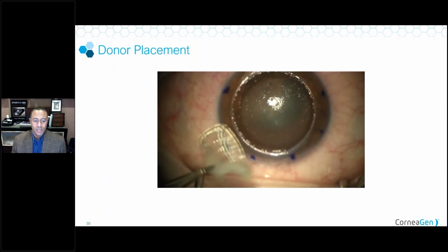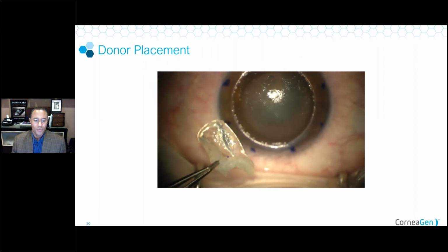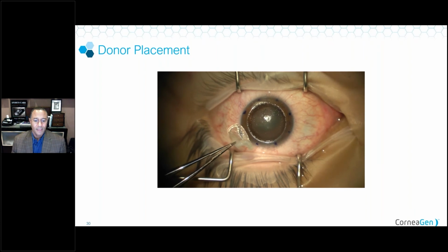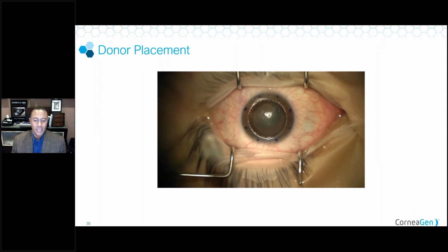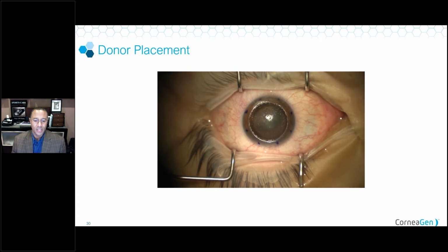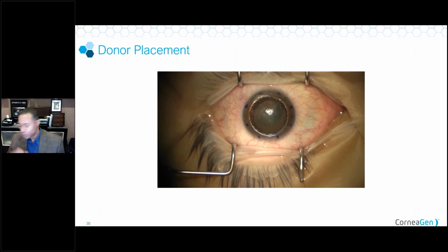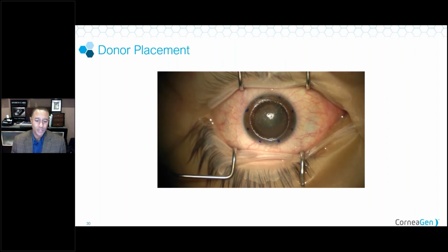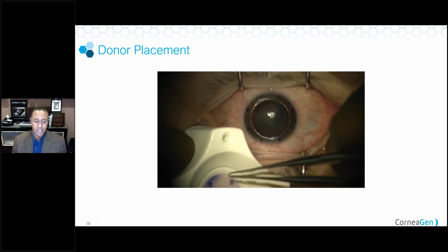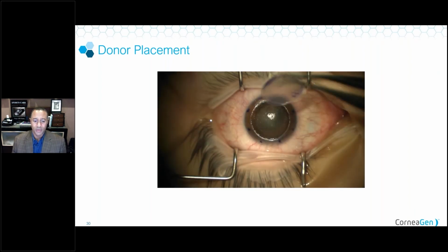This is just giving you a closer look of what's been removed from the cornea. And then we'll take our new donor and place that and just rest it in place. And you can orient that the way you need to. If there's some peripheral arcus, or a little bit of opacity in the donor, you can put that underneath the lid. I'll usually put that superiorly at 12 o'clock.